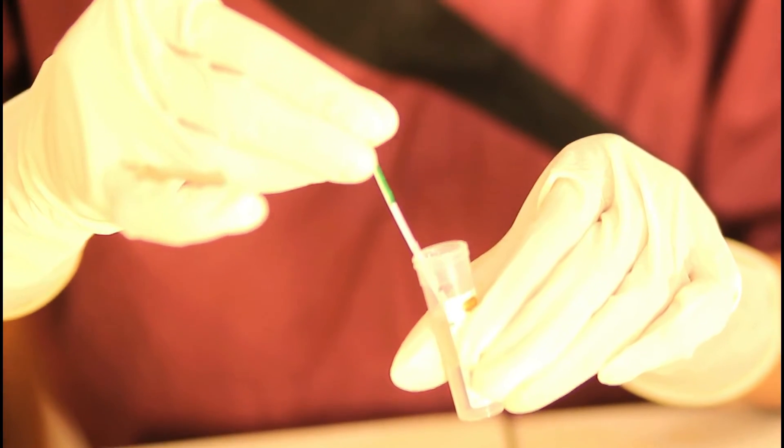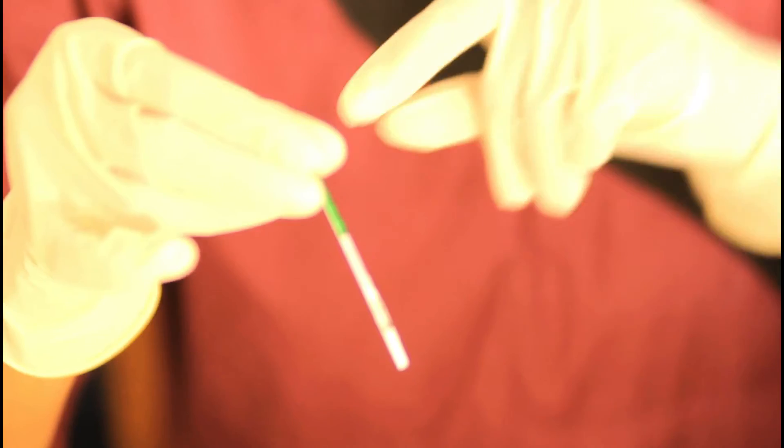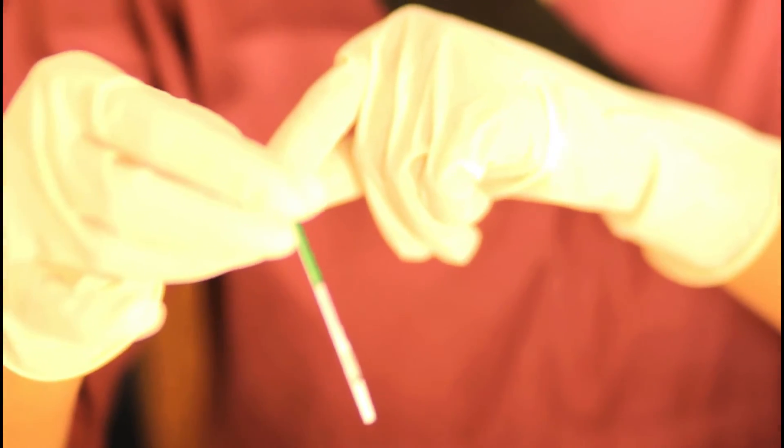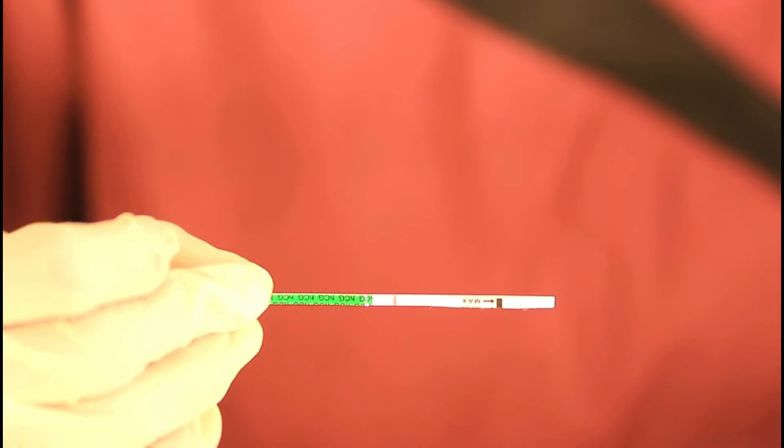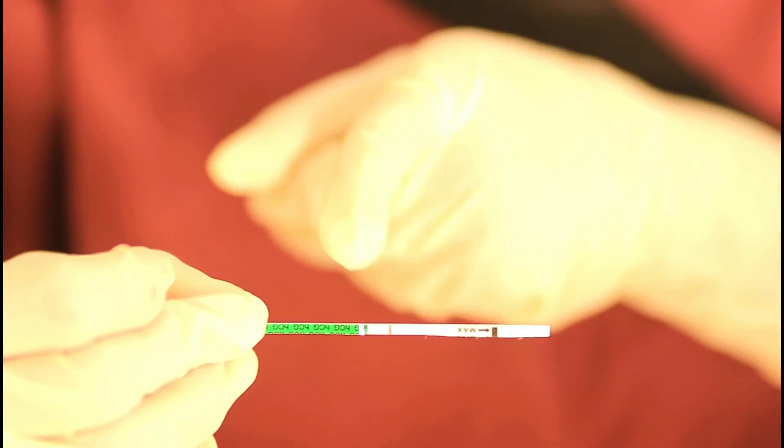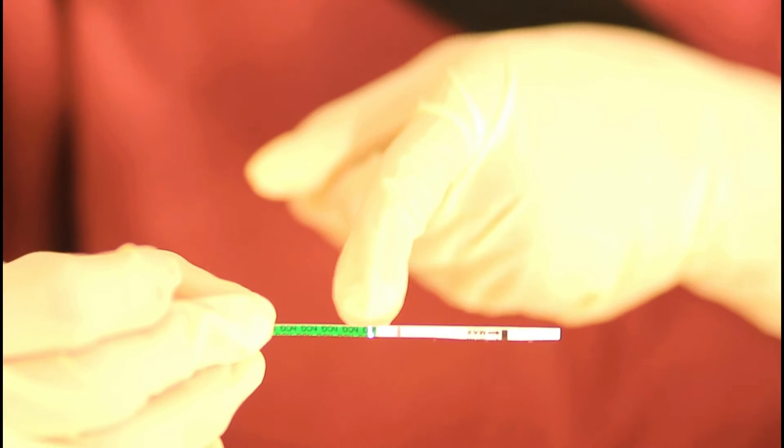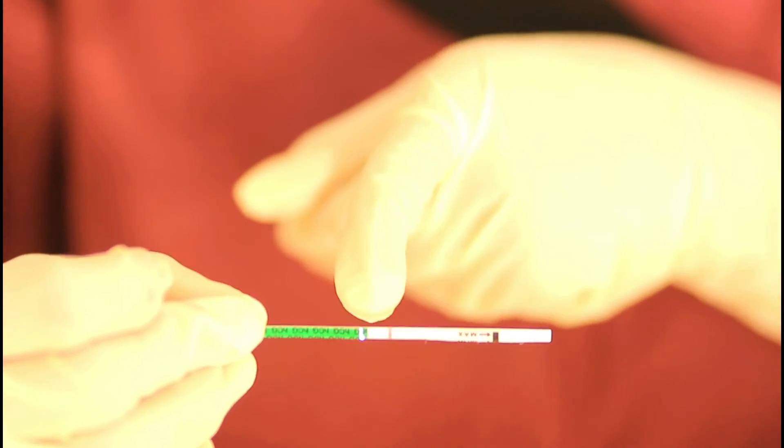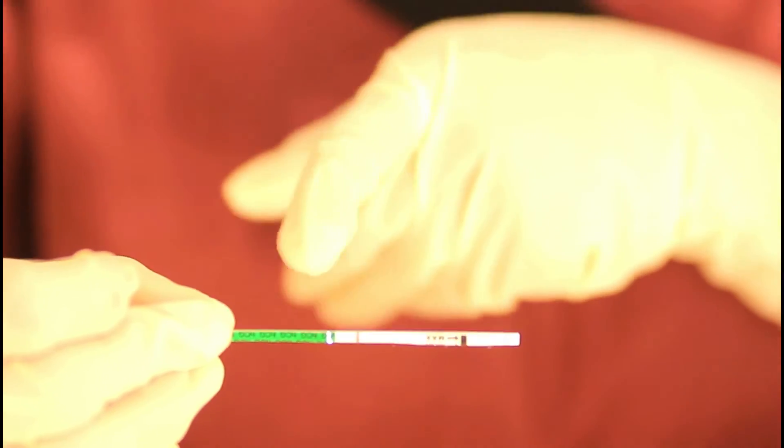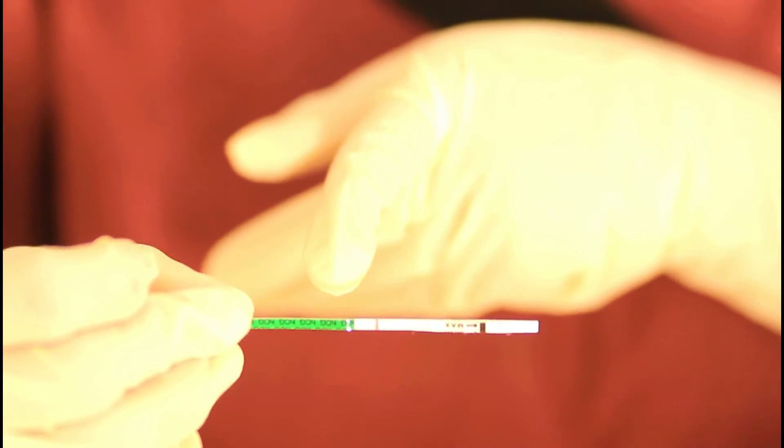Now it has gone all the way up to this point so we are going to wait for about three to five minutes and see the results. After five minutes we can see that only one line appears here closer to the handle which is the control line and that means that the test is negative.